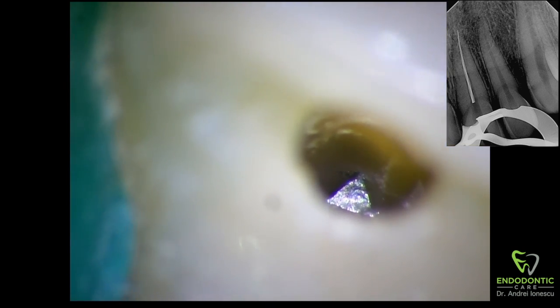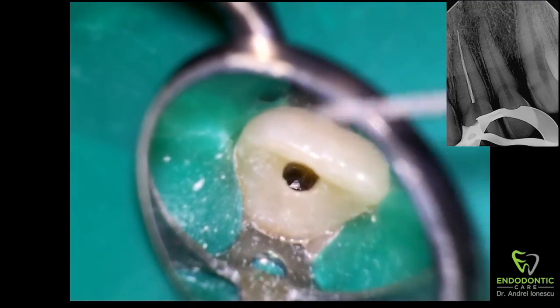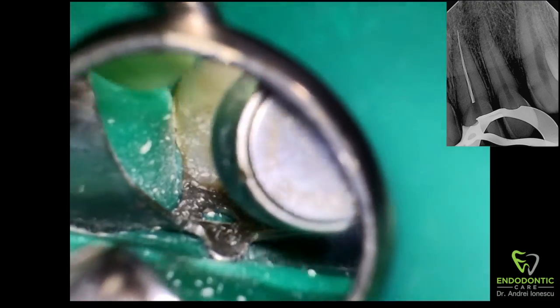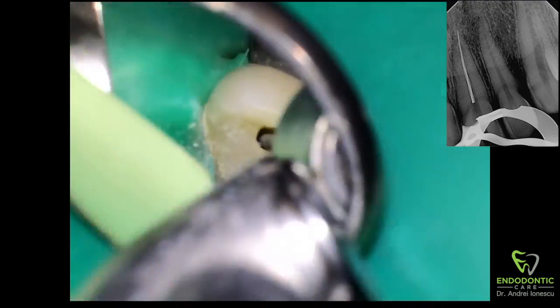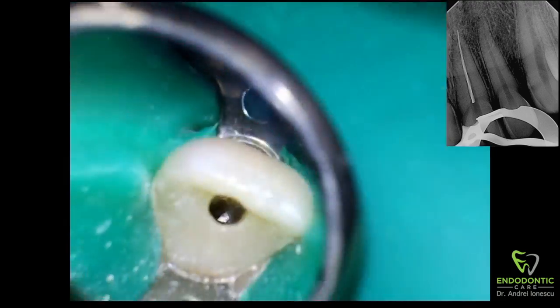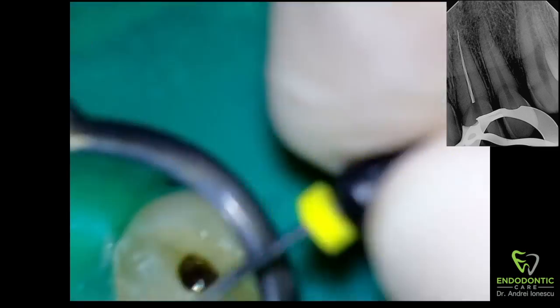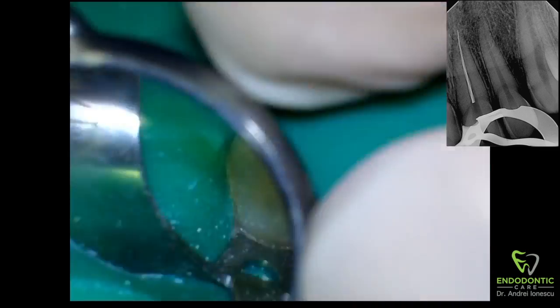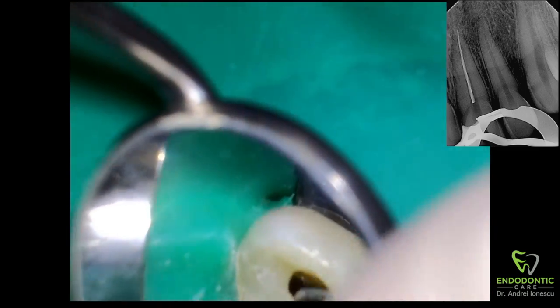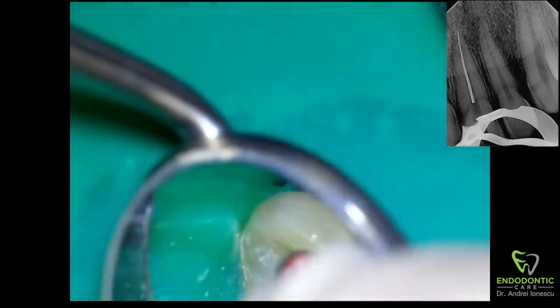I tried troughing in this case but I didn't want to open the access anymore than it already was, so troughing really didn't do much. Then I tried bypassing it with K files and Hedström files to see if I could pull it out, and I even used the braided Hedström technique to try to grab the file and pull it out, but it basically didn't move at all — it was still resting against the buccal wall.